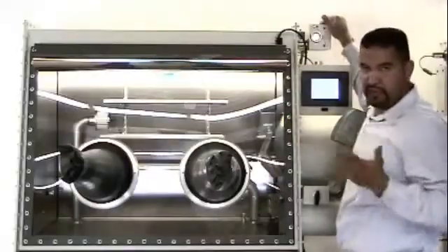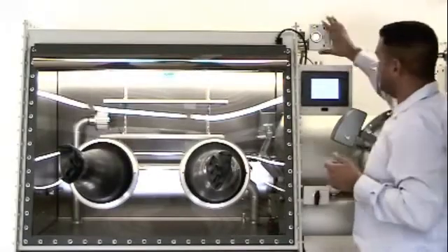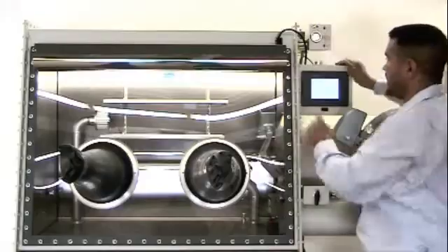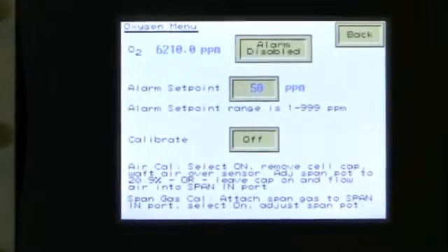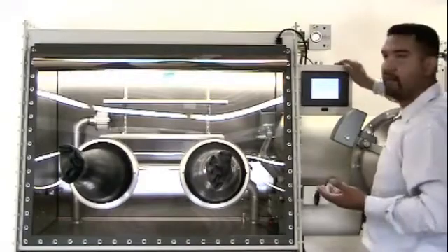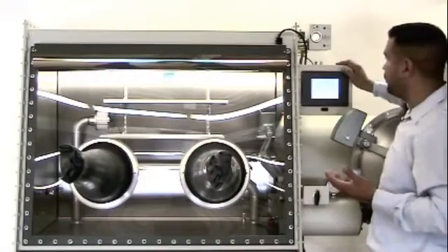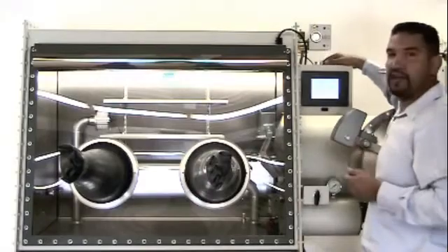Aside from the two millimeter flathead screwdriver for your span adjustment, once you've made your adjustment, simply deactivate the calibration routine and press back to return to the main menu. You should now observe that the oxygen readings are trending down. And that is how you calibrate the Nexus 2 oxygen analyzer.